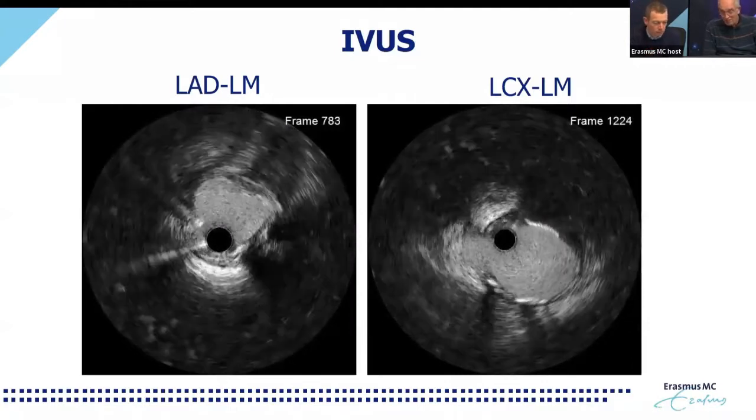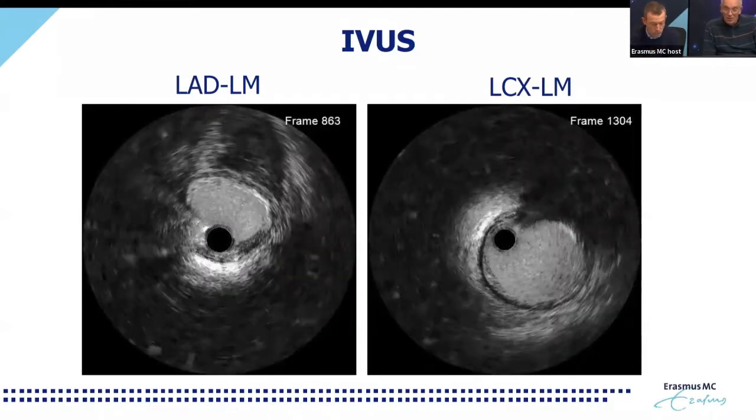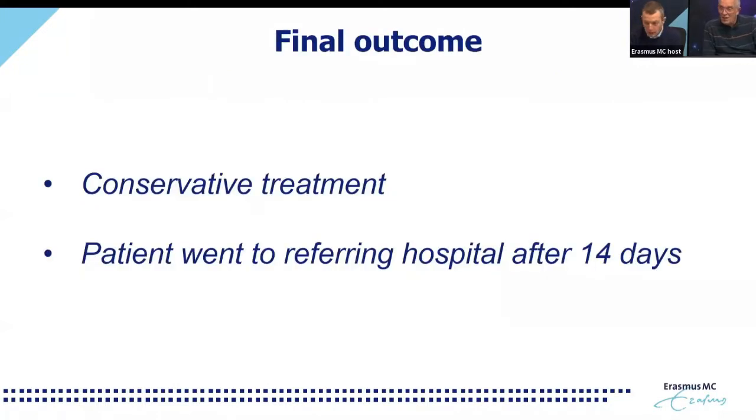And then, Joost, we have a question from... Yes, we have a question.